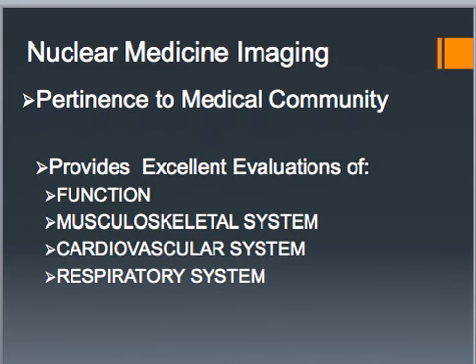It's also good at looking at the respiratory system, looking at the lungs, so it can scan for respiration issues, blood flow problems. It can detect, again, lung transplant rejection. It's good at visualizing the musculoskeletal system, so bones, brain, and much, much more. With the bones, it'll show fractures, infections, arthritis.